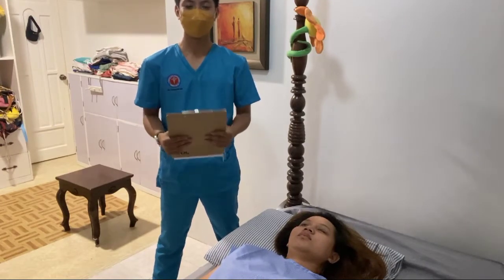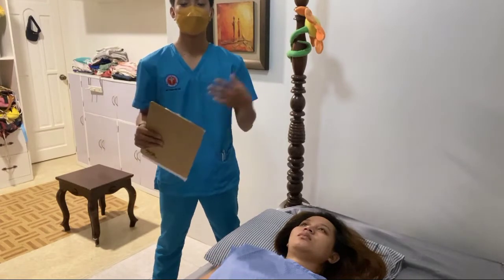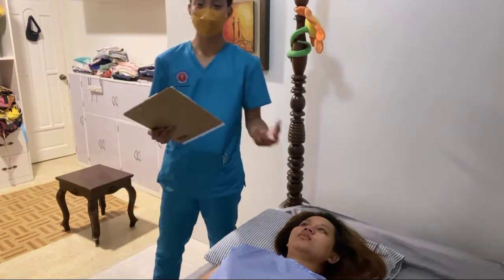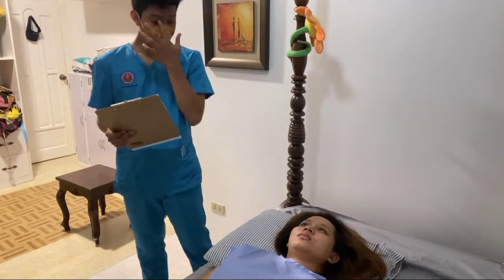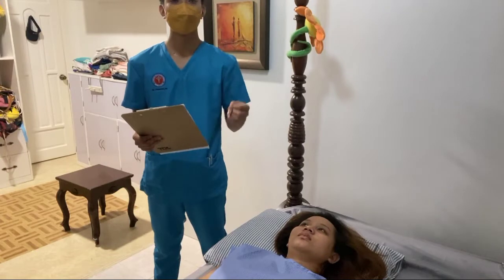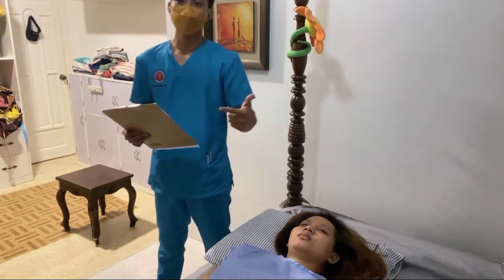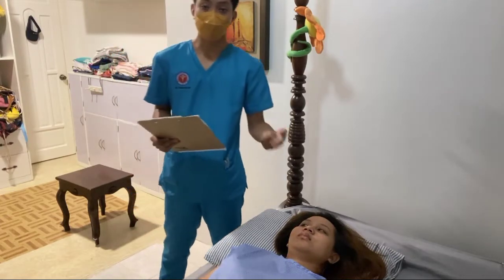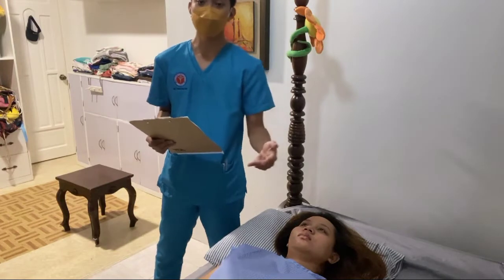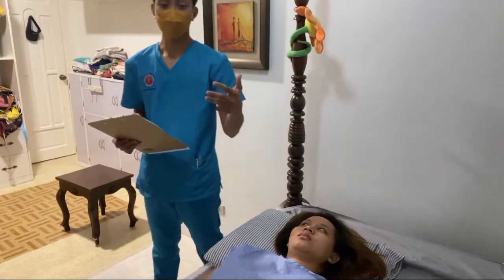Good evening, I am Gianni Nierdino, and for this evening I'm going to perform a return demonstration on ophthalmic medication administration. The drugs administered through this route include effects that help dilate or contract the pupil of the patient, also relieve pain, discomfort, and irritation of the eyes, and also have an antiseptic effect on the eyes and treat infection of the eyes.